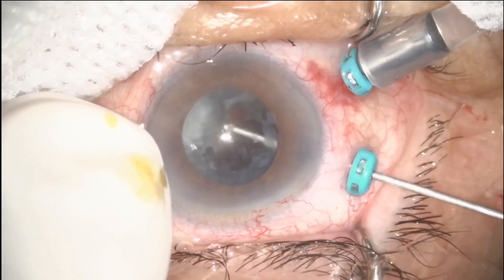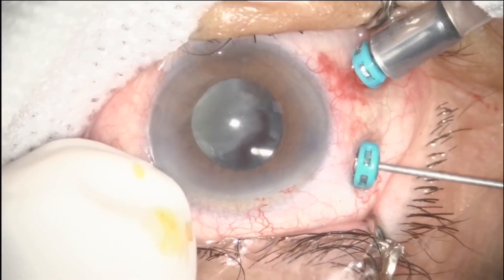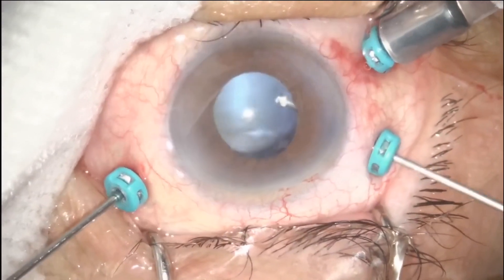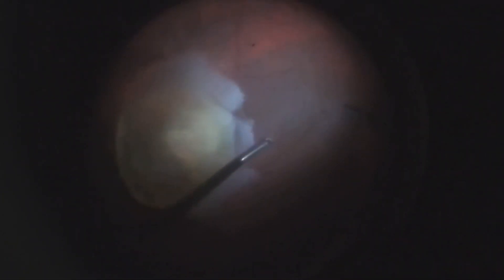If necessary, you can turn off the microscope light and use the chandelier illumination for better visualization of the posterior lens capsule and to avoid damaging the residual capsule support. Posterior hyaloid detachment maneuver is more difficult in the presence of a large nucleus in the posterior pole, but adequate vitreous removal is critical to prevent iatrogenic breaks.